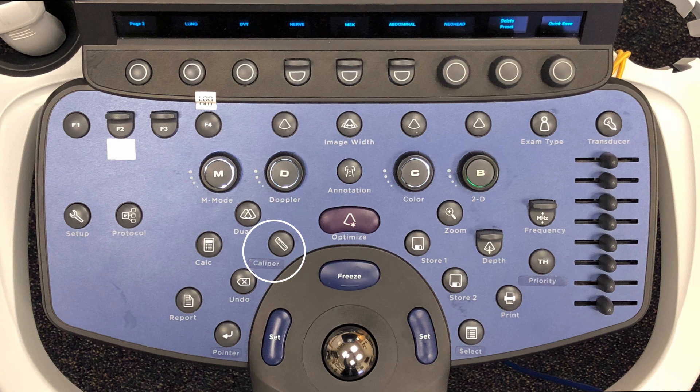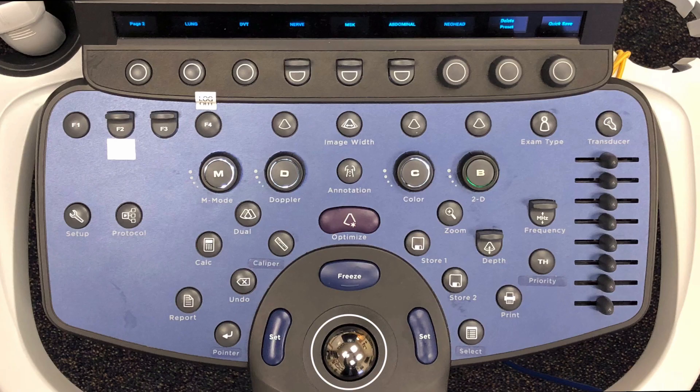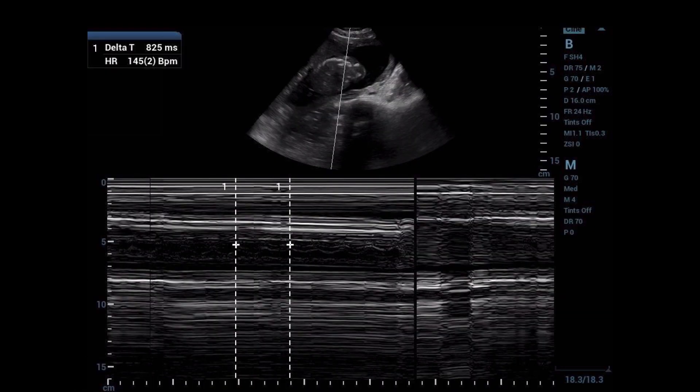The system comes with built-in caliper and calculation functions based on your preset. The caliper button brings up the caliper menu to measure structures on the image — most have either distance or distance with depth as their default caliper. The caliper menu is displayed to the left and you can choose which caliper you want to use with the trackball. The item measured is displayed in the right-hand corner. Click the set key to set the mark and bring up the other caliper mark for your measurement. The calculation button brings up the calculation package menu for the active preset — not all presets have a calculation package; most commonly used are OB and cardiac presets. OB has an auto OB setting that will auto-measure gestational age based on the image obtained, or you can use the manual modes listed below. After measuring, the calculated value appears in the dialog box on screen — these images with values should be captured for archiving. Here you can see the fetal heart rate calculation since we are in M mode tracing on the OB preset.